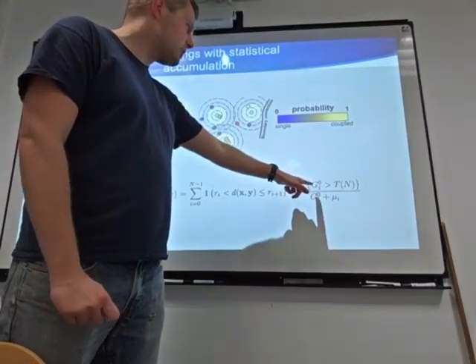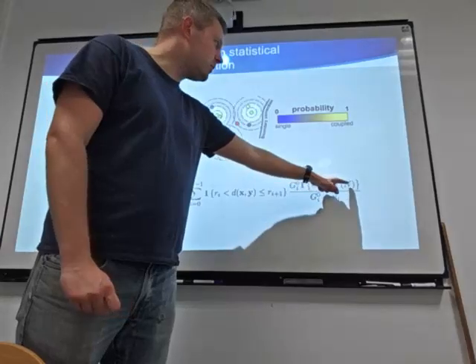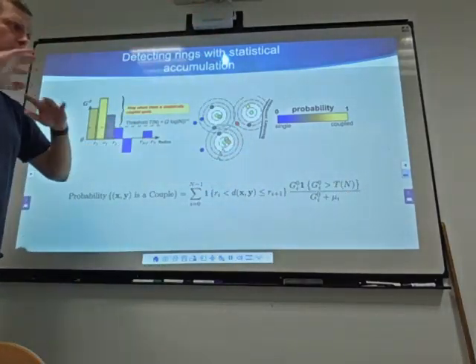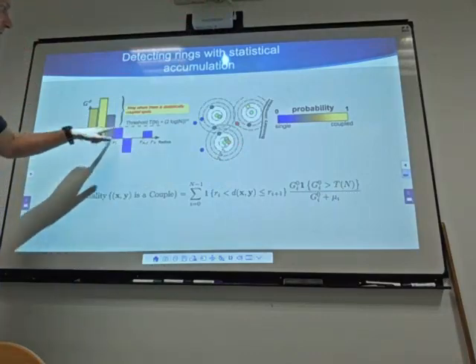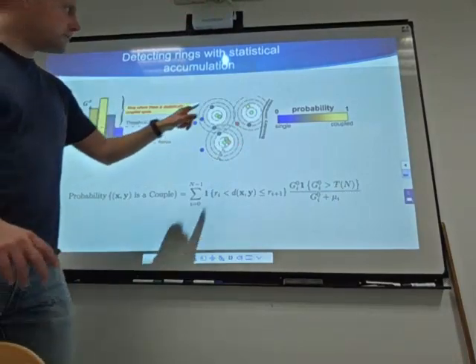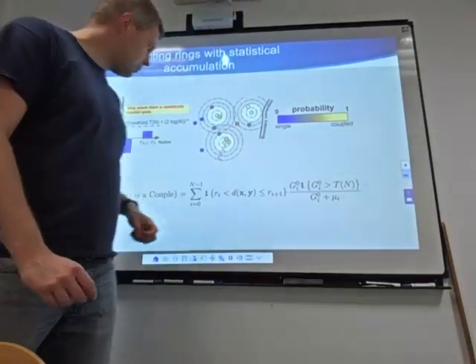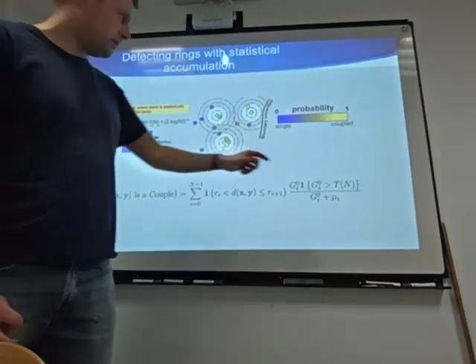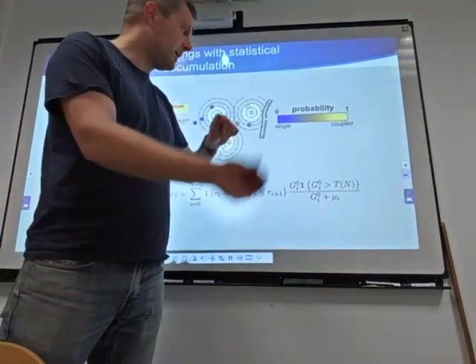So here, this is a condition that you are going to consider only the rings that are above the threshold. So you don't want to get information from these rings, which are noise. And in this ring, you are going to look at, yes, because there is 0, because I have removed the mean.